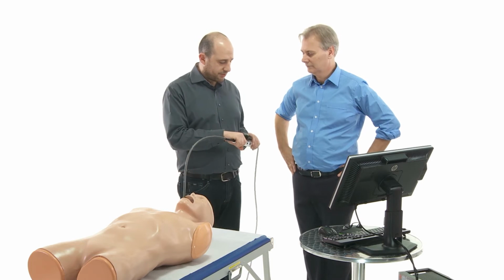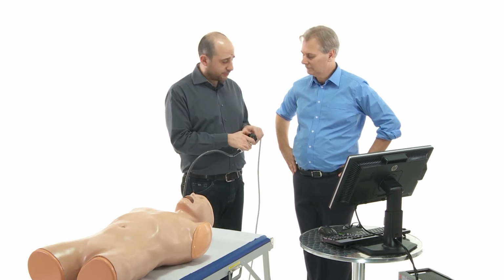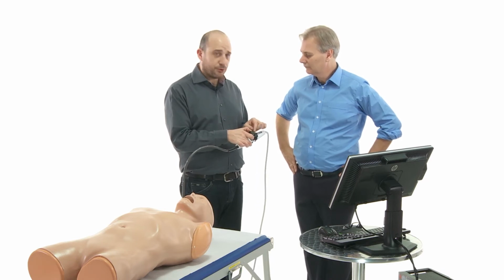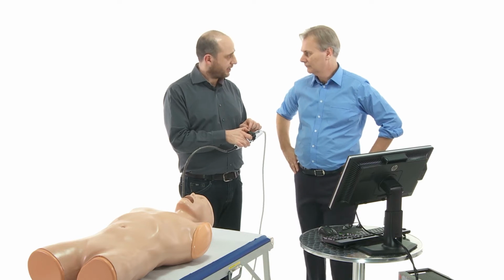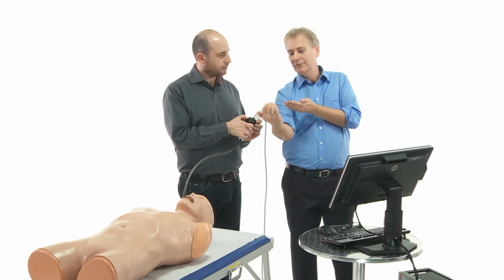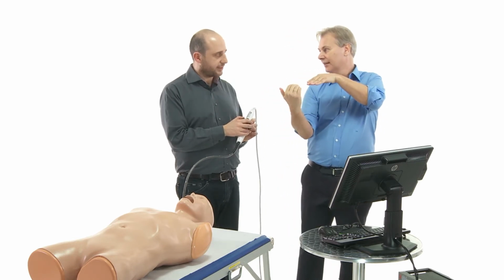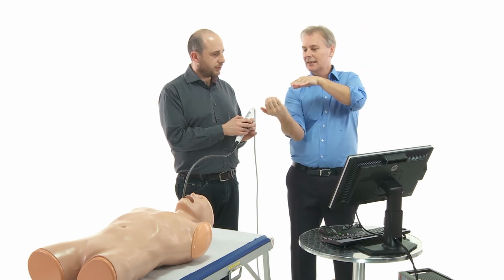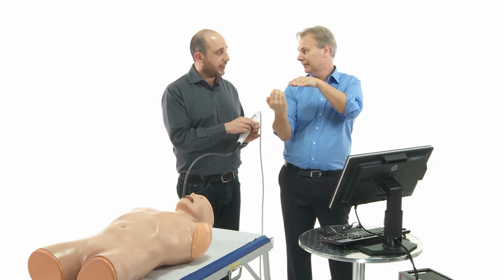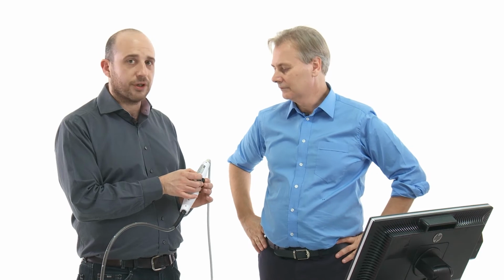That means the tip of the probe is on the body of the stomach. Then you can perform the anteflexion and the flexion to the left side. That means you have to turn the 2 wheels in the opposite direction. So that means you have the probe in the stomach and you are now retroflecting it back towards the heart. Yeah, to the heart again. Exactly. This is the motion you do, and the sideways motion is also important so that you don't diverge away from the apex, right? Exactly, exactly. And that's why you use the left flexion.